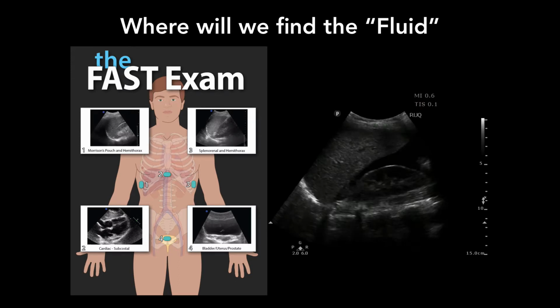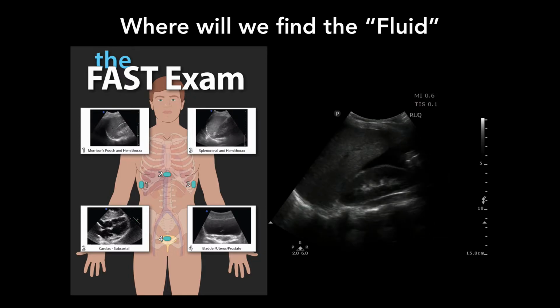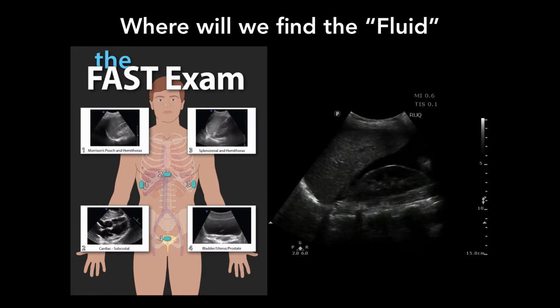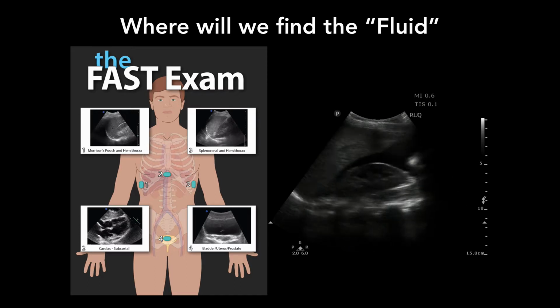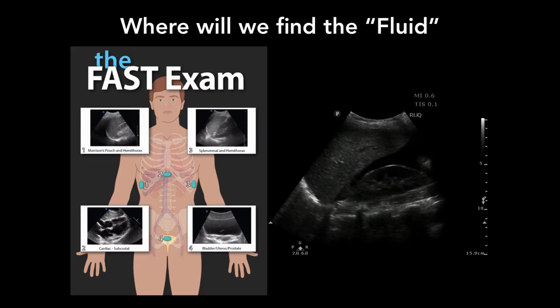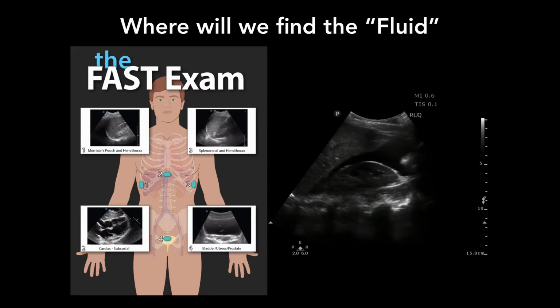Look at the spine. See the spine coming up and it stops? So is there any fluid up in the chest cavity? No. So this person only has fluid in the abdominal cavity. And how do you know what the fluid is? With your brain, right? Clinical history.